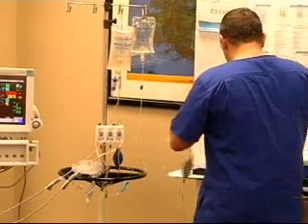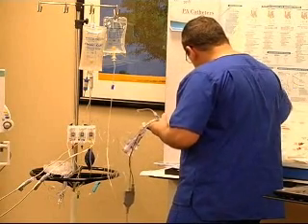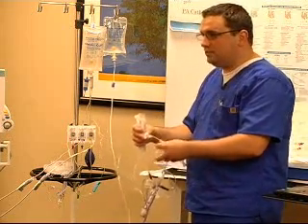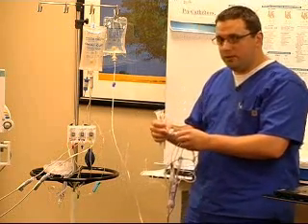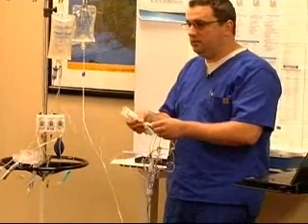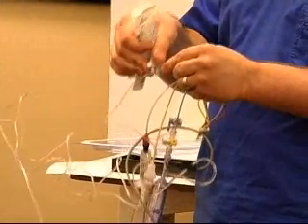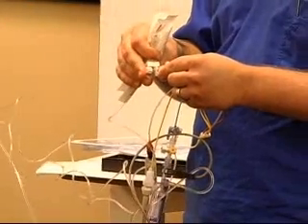Now where will we draw that mixed venous sample? We're going to pull it out of the PA line. Now this is the only time you're going to be accessing this. Of course, whenever you're talking about the basics and parameters of PA lines, you never, ever, ever, ever infuse through the PA line, right? This is a big no-no, infusion. Don't do that. The only thing you really do with the PA line, besides monitoring it on the waveform, is to draw your mixed venous sampling.